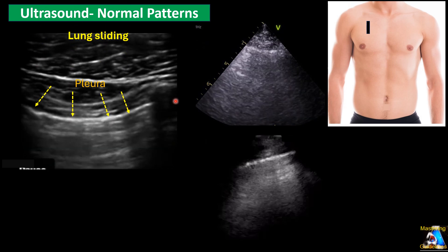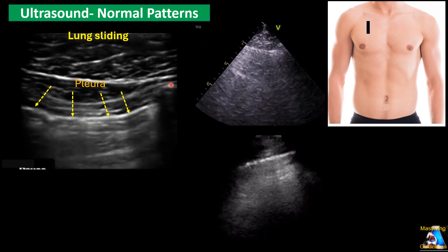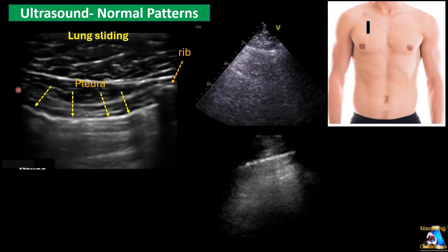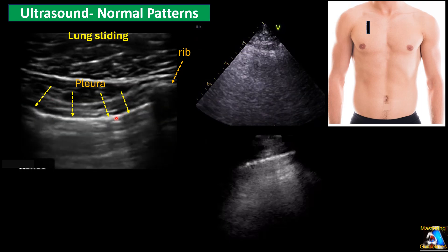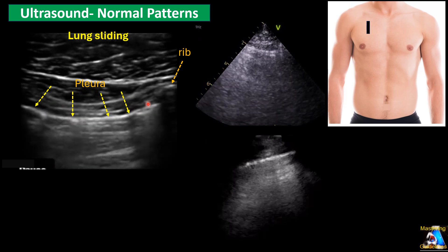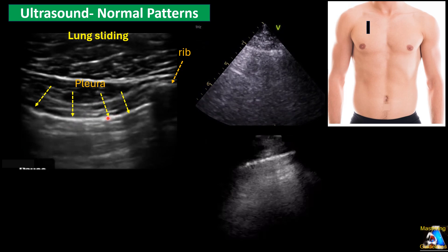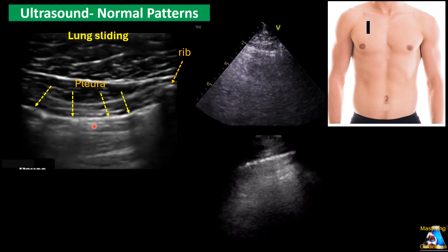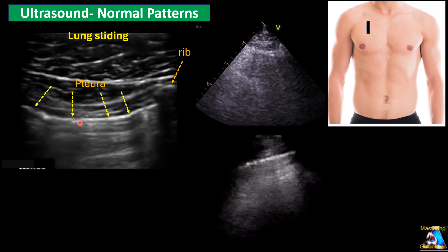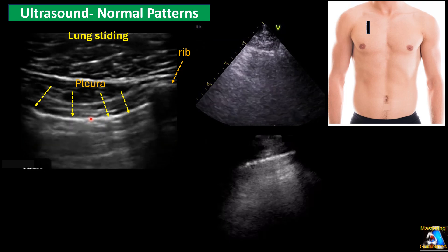We have other structures we can see here. The rib has a hyperechoic surface and posterior shadow. If our probe footprint is big enough, we can see another rib here, which gives us a face of the frog, or sometimes called the bat sign. The most important feature we can see is sliding of the pleura, which we call lung sliding or the sliding sign. This is a very important finding.